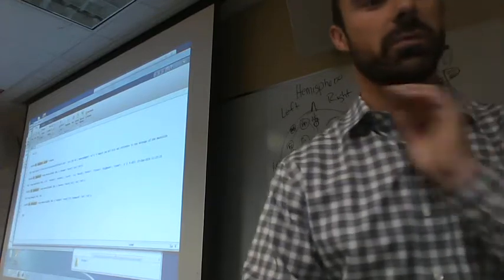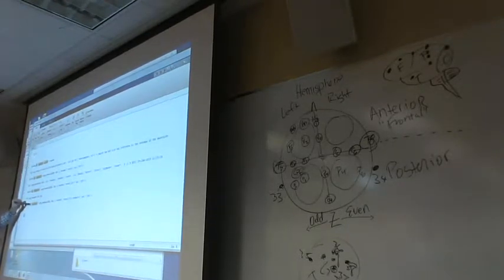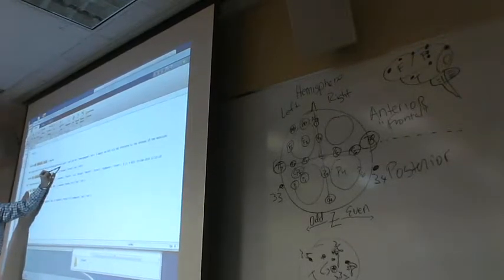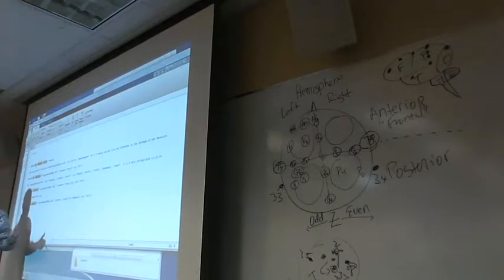Now let's look at a couple things that we've got to do here, okay? One thing is, if we were to loop through here, we said for each subject that goes through this loop, do this stuff. Well, there's a couple problems here. When you open up the 5th subject's data and it does exactly what you tell it to do, it's going to grab the 4th one. So somehow we need to come up with a way to change these numbers, but not with our hands, because that's the Stone Age, right? We want to use a nail gun, not a hammer.